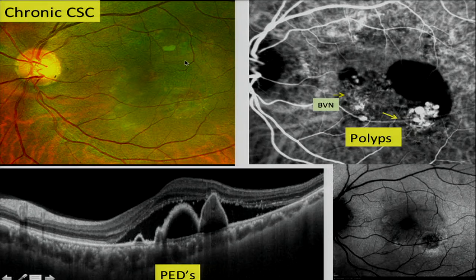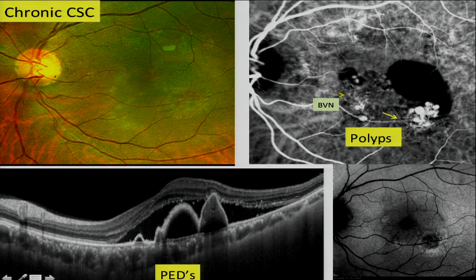This is another case of chronic CSC where on doing the ICG you pick up the lesion. The role of ICG is immense and FA plus ICG can be done together. ICG picks up the polyps clearly while FA doesn't. You can also see the branching vascular network on ICG.